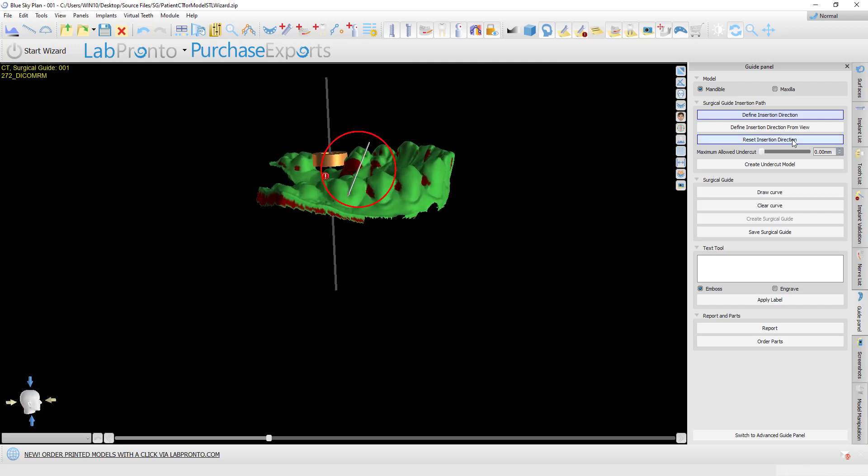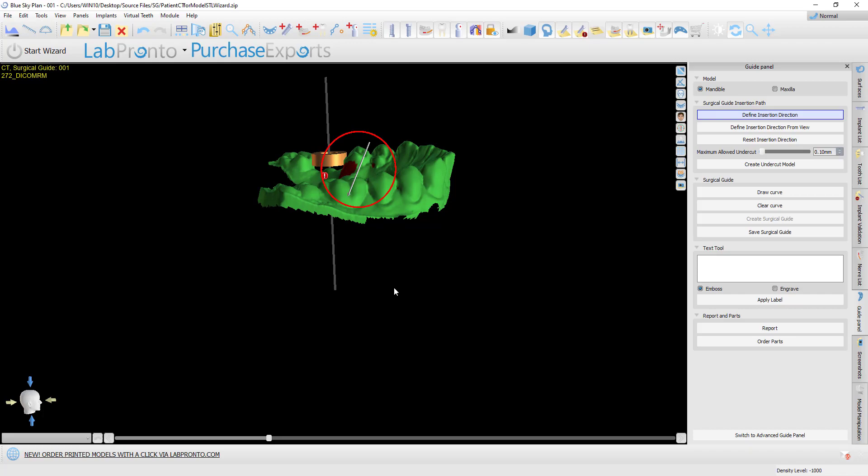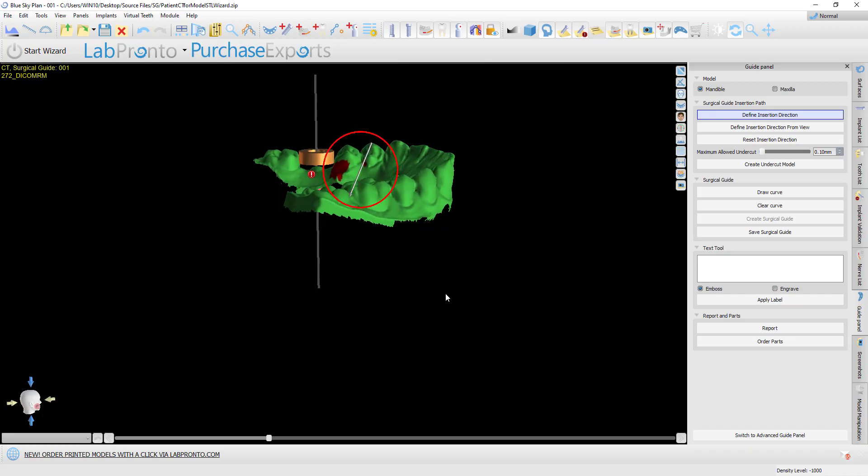The default is 0.1. We recommend keeping that default unless you have a particular need. Raising the slider value means you're allowing more undercuts to remain on the model.